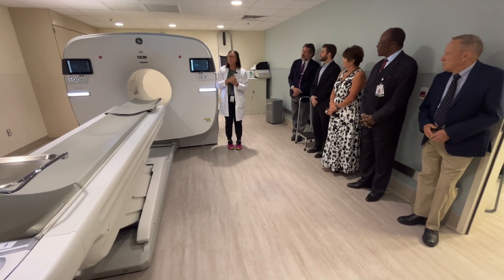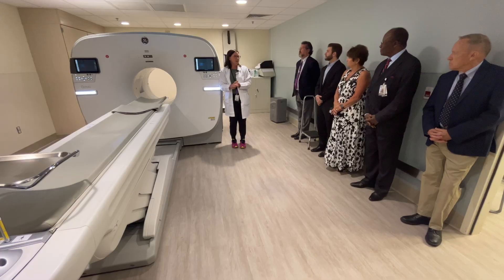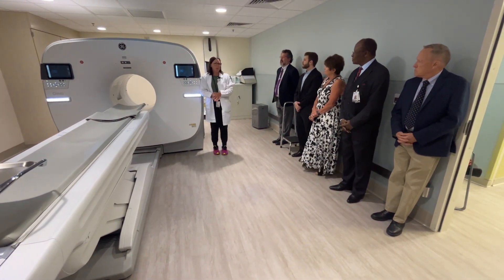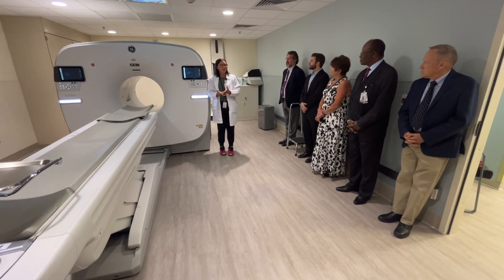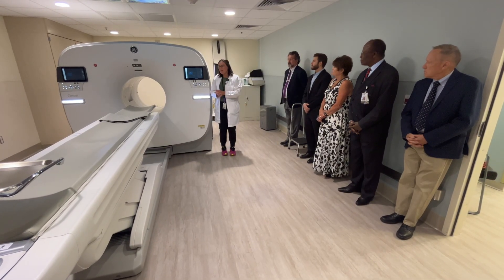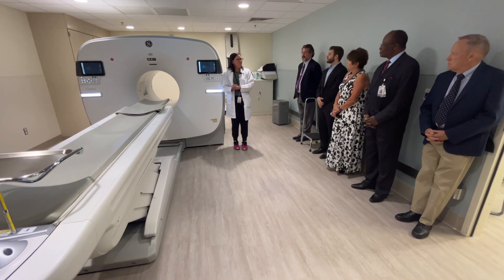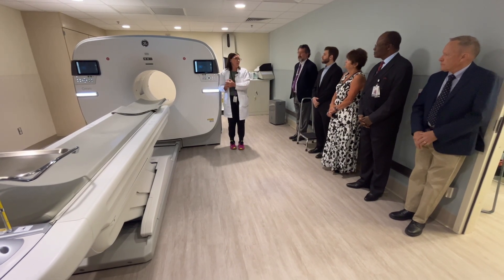Every patient that comes for a PET CT scan always gets a low-dose CAT scan for anatomical overlay. The CT or CAT scan shows anatomical detail, and then the PET portion — which is part of molecular imaging — shows the function of your cells. So if there is a tumor anywhere in the person's body, the radioactive isotope that they have been injected with will bind to those cancerous cells and they light up brighter on the scan.